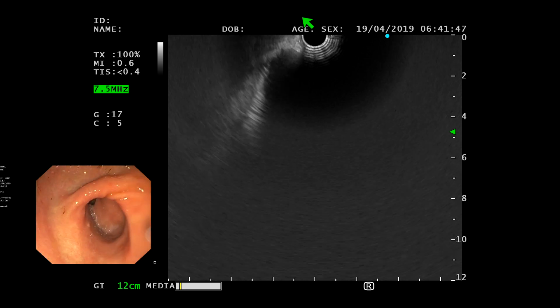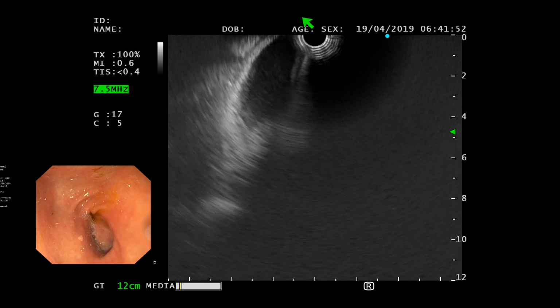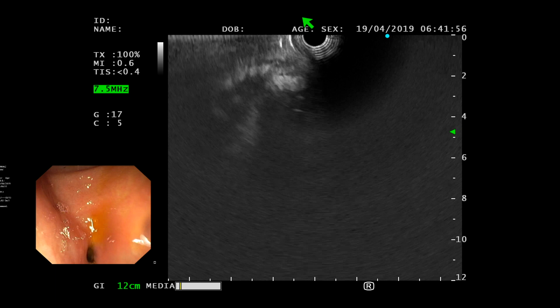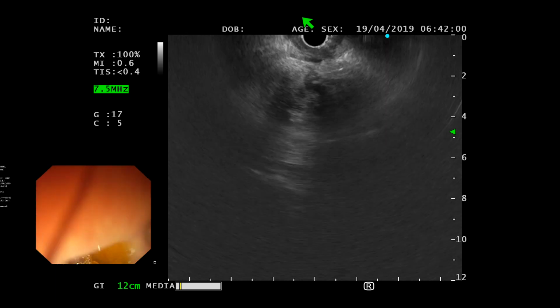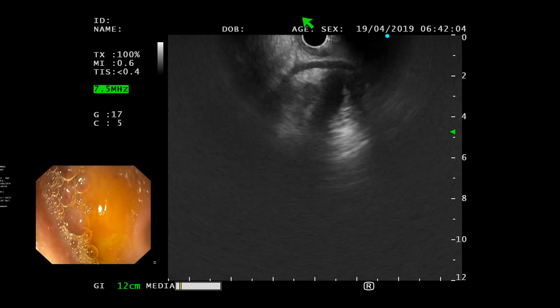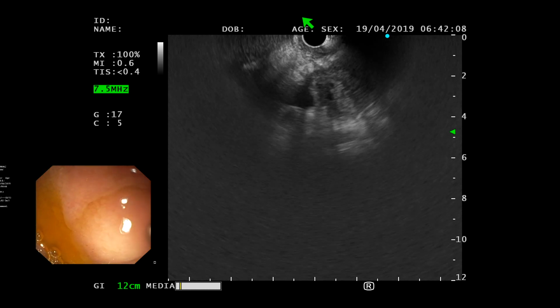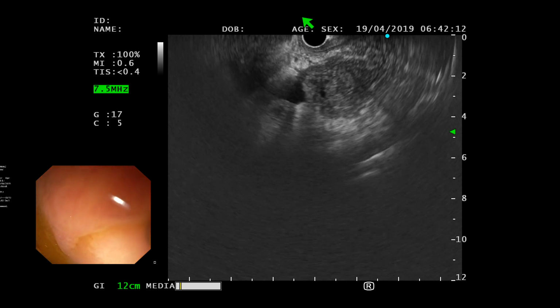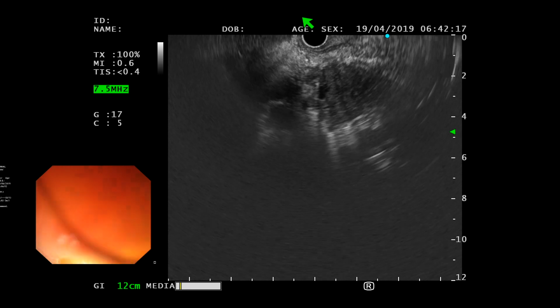Mustafa, are you with me? Are you there in the audience? We're with you. Okay. Yes, thank you. In a patient like this where we have multiple lymph nodes, how many of us in the audience would like to do a biopsy of the primary lesion? The multiple rounded lymph nodes in the paraaortic region. So, could you just remind us the clinical context? How old is the patient? The patient has got a periampullary mass possibly, and then a stenting has been done.